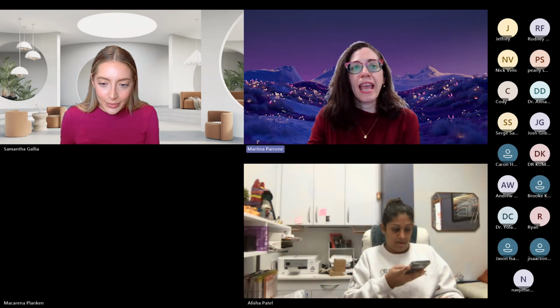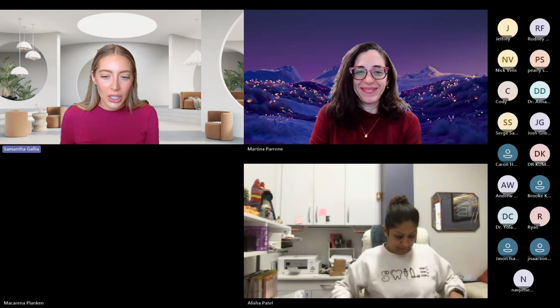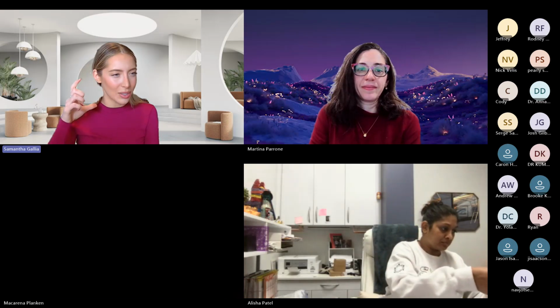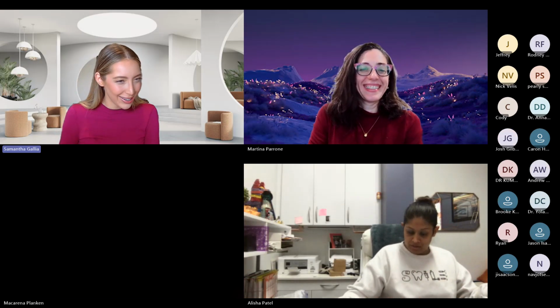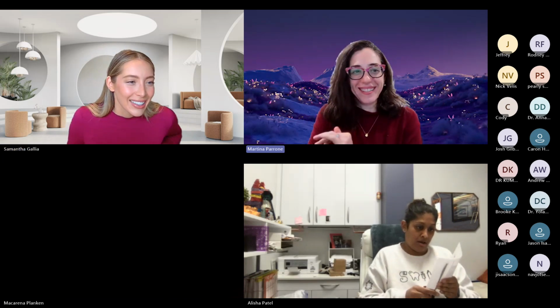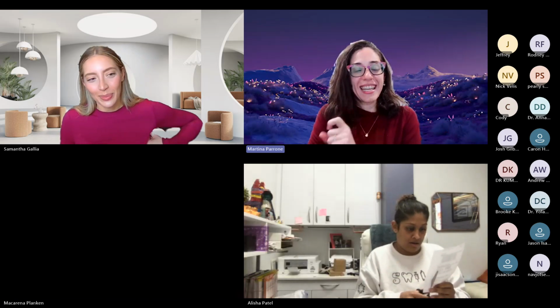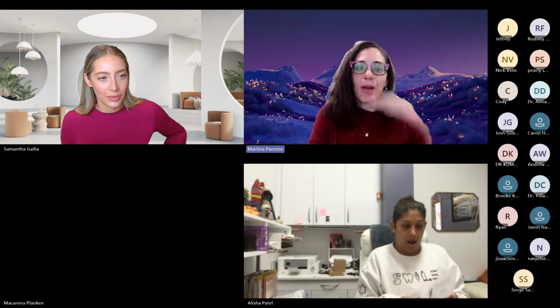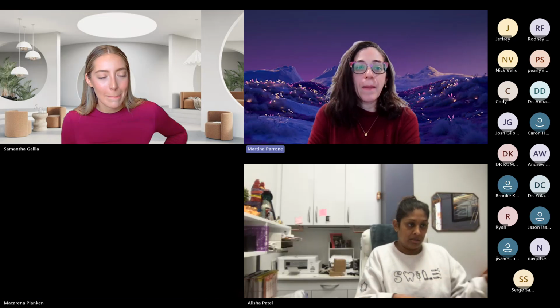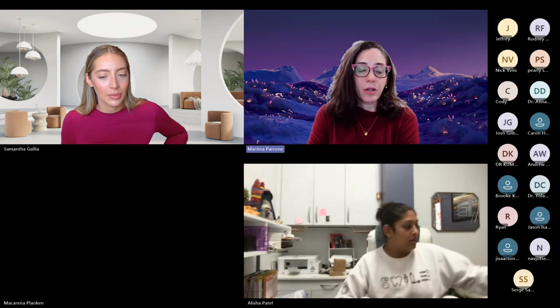And then, will the size 8x8 include the TMJs? That's a good question. I think typically 10 by 10 is the one that includes the TMJs at least, right? Every machine is actually a little different. I actually just went through this with an office, so I thought the 10 by 10 would include it, but it doesn't. On kids, you'll probably get the 10 by 10, but on large males, you will miss it. It depends on what your client base is, but I would recommend doing a larger field to get the TMJs included.